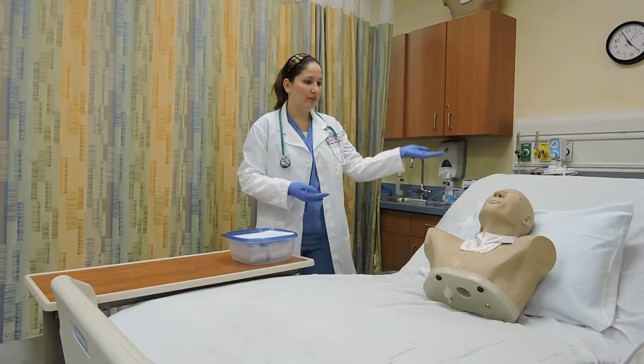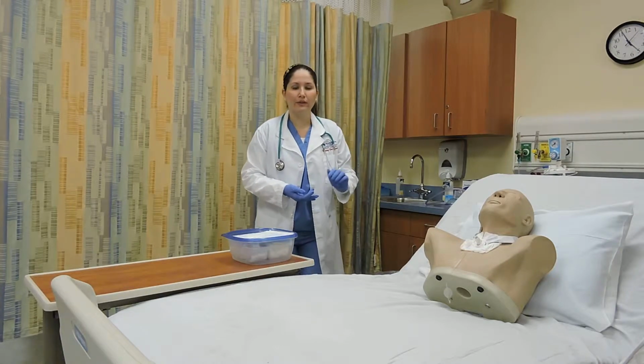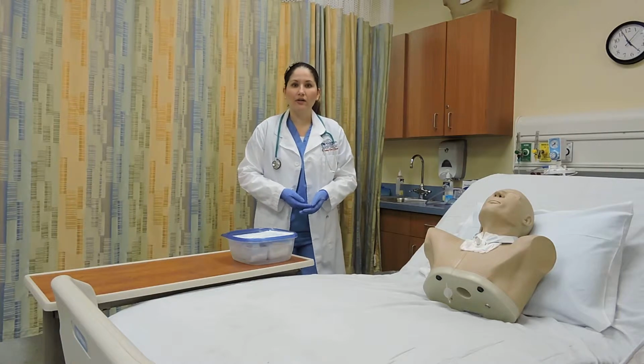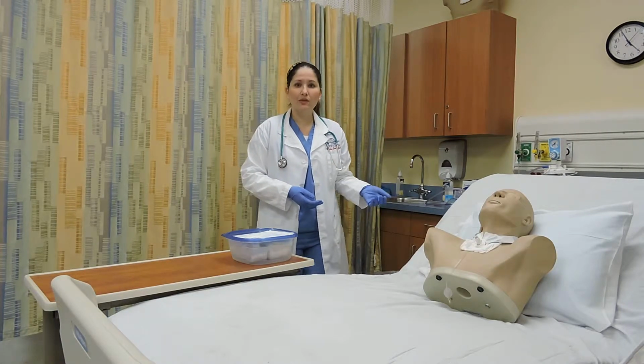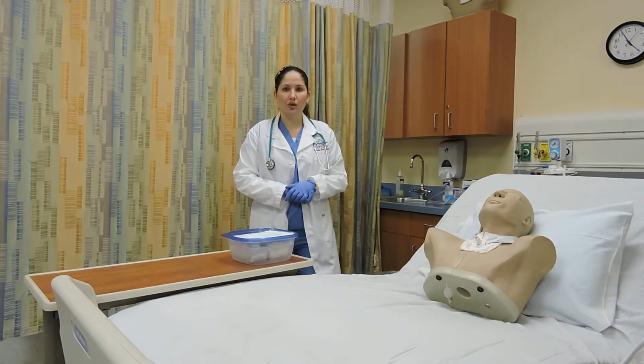Now I will position the patient in semi-Fowler's position and assess the vital signs: heart rate, respiratory rate, SpO2, and breath sounds. If I hear coarse crackles, I will suction the patient before the procedure, hyperoxygenating him before and after suctioning for at least 30 seconds.